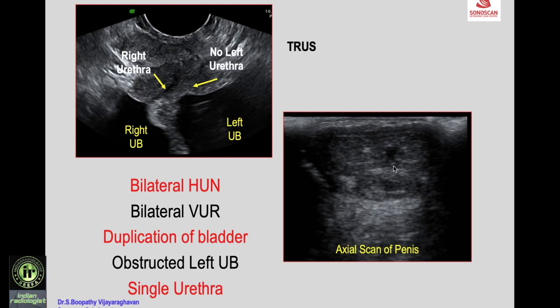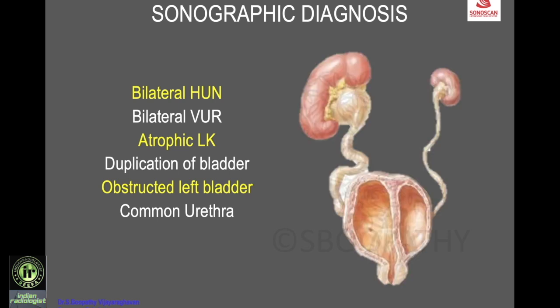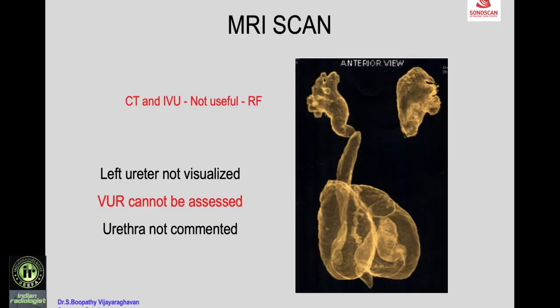Transverse scan of the penis shows the corpora cavernosa and corpus spongiosum with a single urethra. On ultrasound: bilateral hydroureteronephrosis, bilateral vesicoureteric reflux, duplication of the bladder with obstructed left bladder, and a single urethra — giving the complete diagnosis of bilateral hydroureteronephrosis, bilateral VUR, atrophic left kidney, duplication of the bladder with obstructed left bladder and a common urethra.